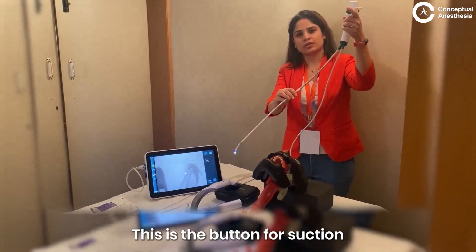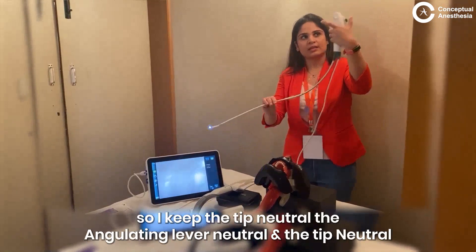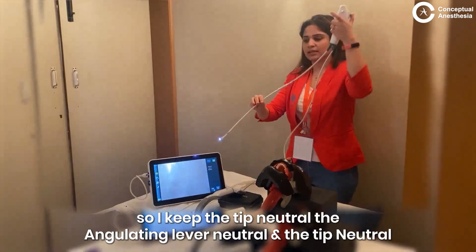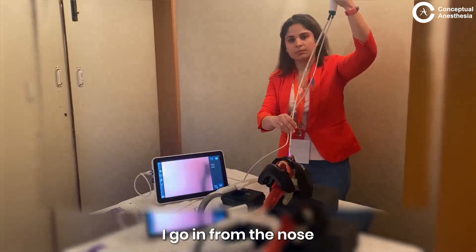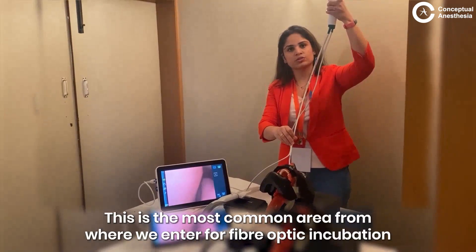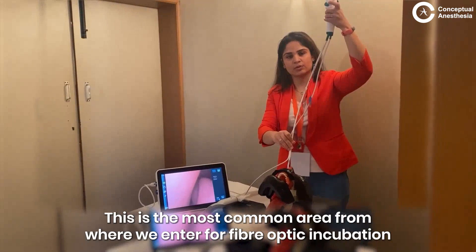This is the button for suction. I keep the angulating lever neutral and the tip neutral. I go in from the nose. This is the most common area from where we enter for fiber optic intubation.